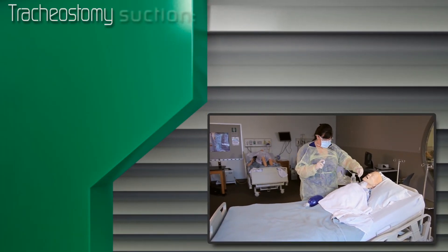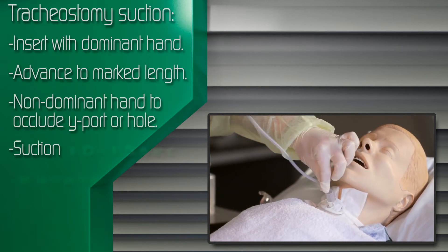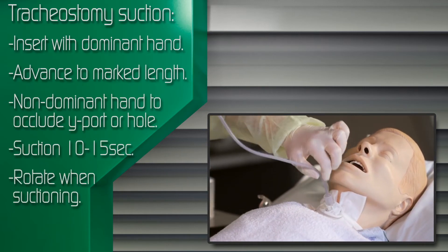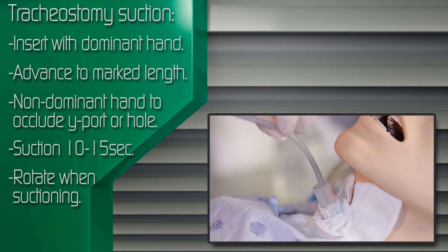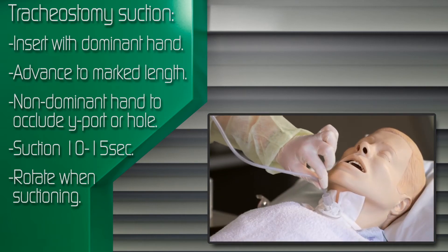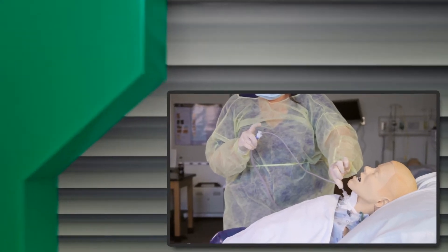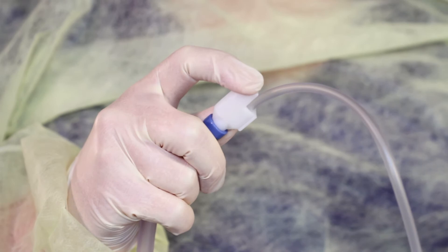Quickly and gently insert the catheter into the trachea with your dominant hand. Advance to the predetermined length. Apply suction by intermittently occluding the Y port or open hole of the suction catheter with the thumb or index finger of the non-dominant hand.